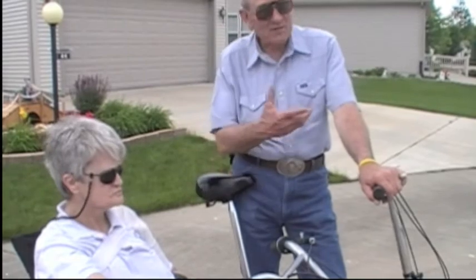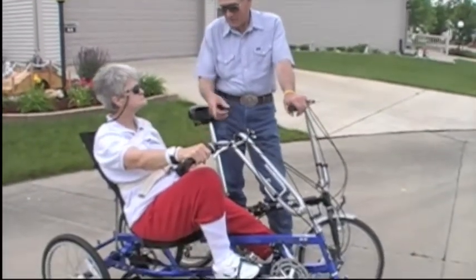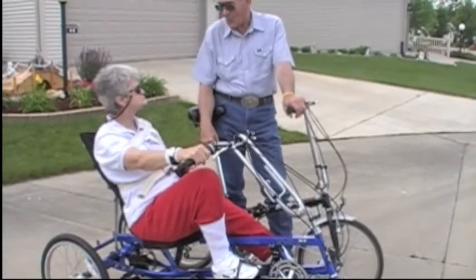This — it looks to anyone else seeing you on the side, you look like just any other cyclist out there. They don't realize it's all a one-leg and one-arm operation. But it really works good.